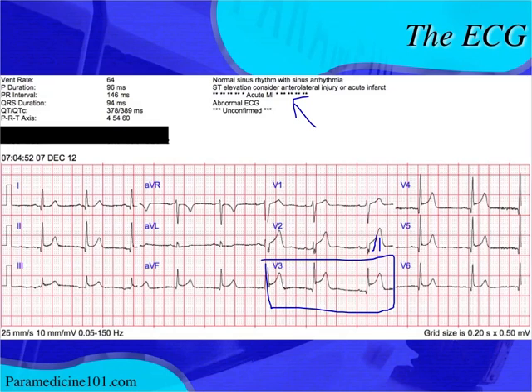You have to consider the company it keeps. Meaning, don't just look at a 12 lead. Just like they say, treat the patient, not the monitor, when you're in EMT or paramedic school. I'm saying it does hold true. You have to consider your patient's symptoms.